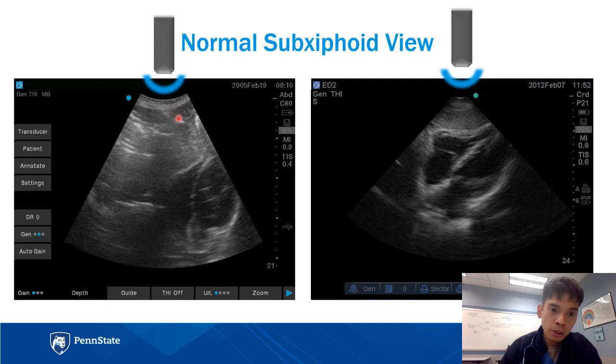And then we also see two circular hypoechoic structures here that some people may have and you will see, and some people may not have. Can anybody guess what this may be if it's exactly midline? It would be some abdominal muscles if your patient has it, okay? Abdominal muscle here and abdominal muscle here. As we go deeper, we see this one big structure right here. That's the same echogenicity, and that would be the liver.